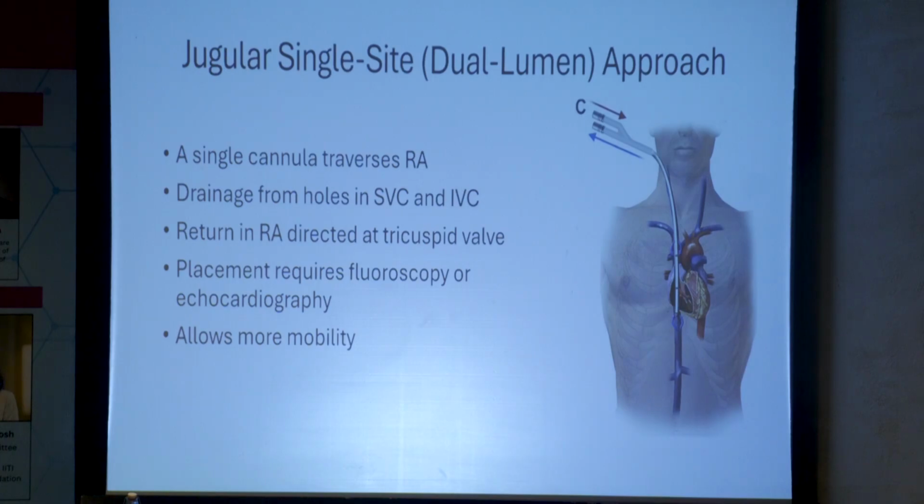If you were restricted to femoral because of whatever consideration, having femoral-femoral cannulation is probably more straightforward than trying to do a femoral single site. And most importantly, the cannulas don't exist. So unless you want to invent one and become the... yes, Steve. I've never seen anybody use a dual lumen for femoral. Like they said, the length is going to be problematic.